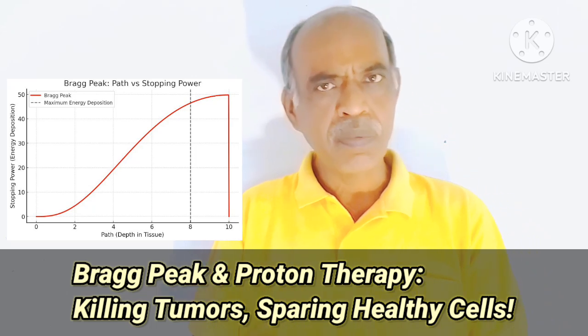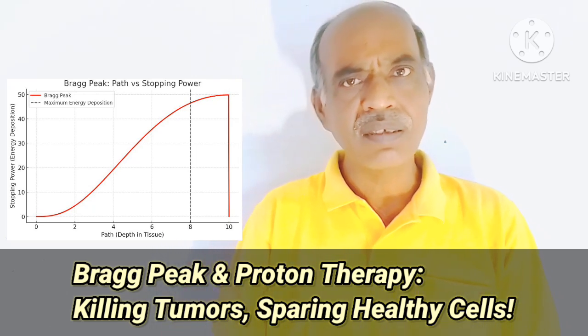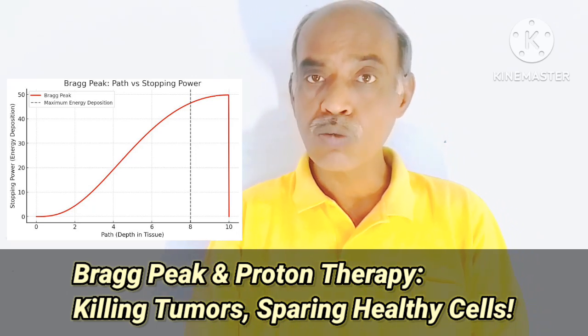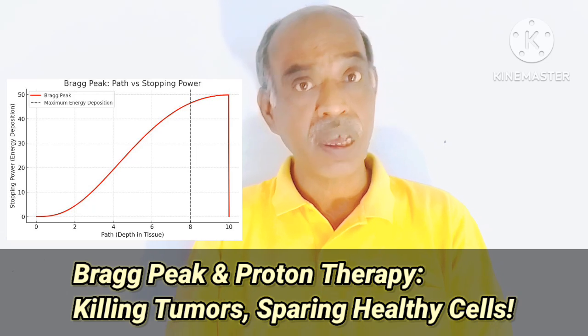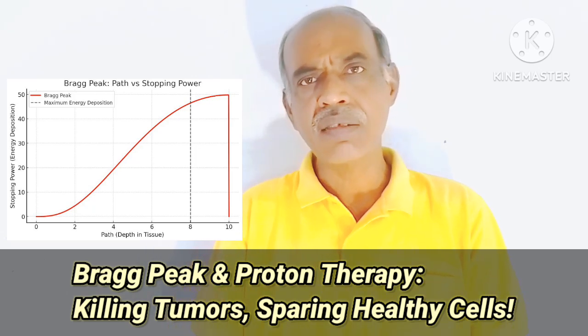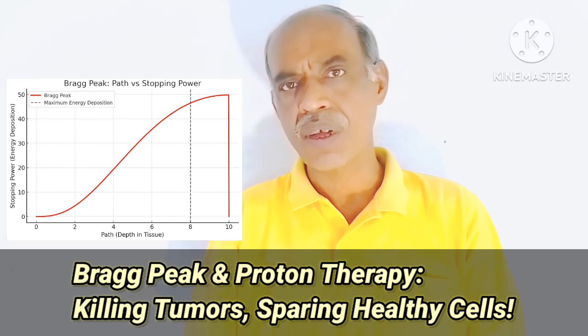Okay, so that means proton therapy is a targeted therapy. This is one positive point of proton therapy, and that's why it is widely used in leading cancer treatment centers. Next is minimal side effects.